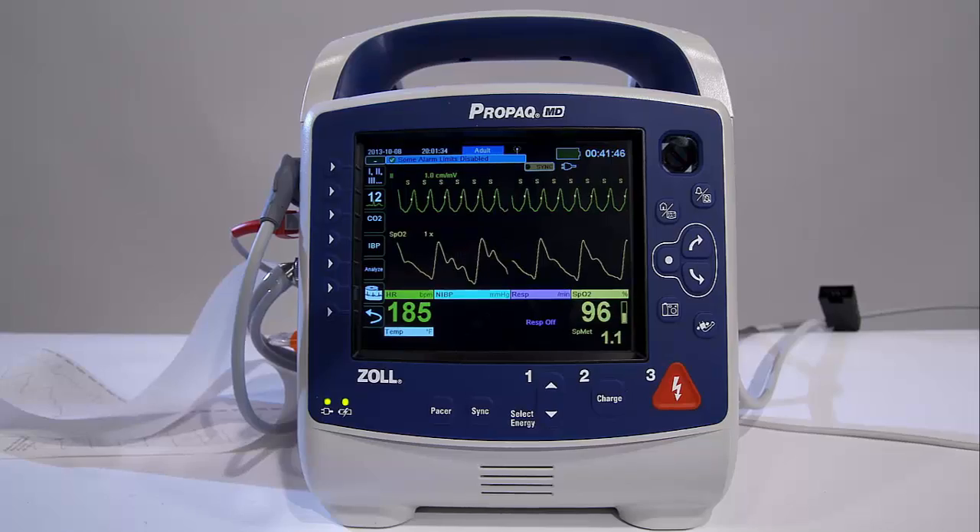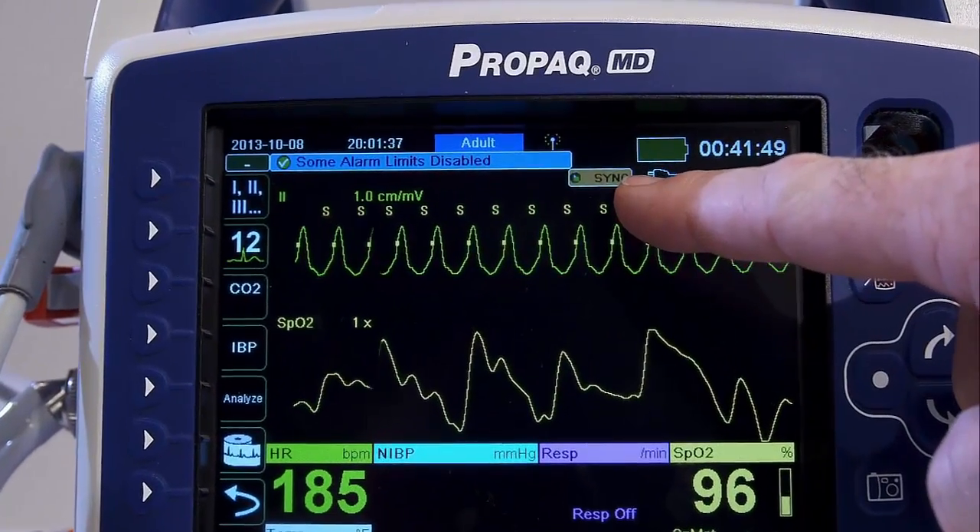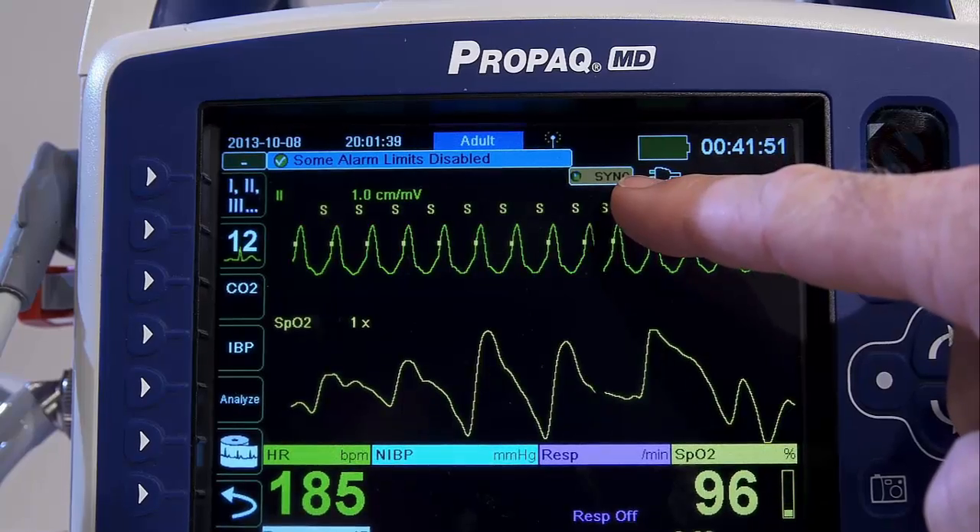The marker "S" appears above each detected R-wave to indicate where the discharge will occur.